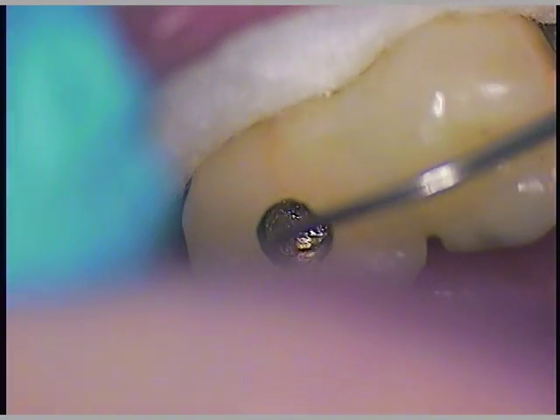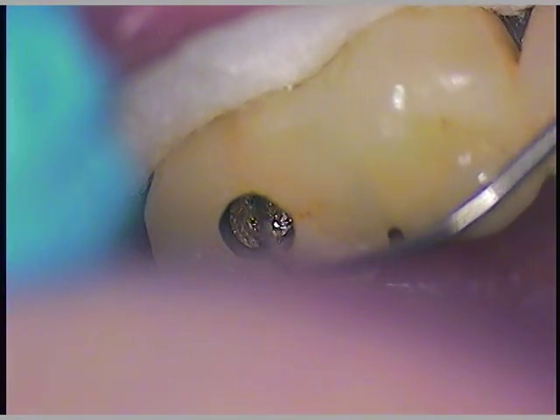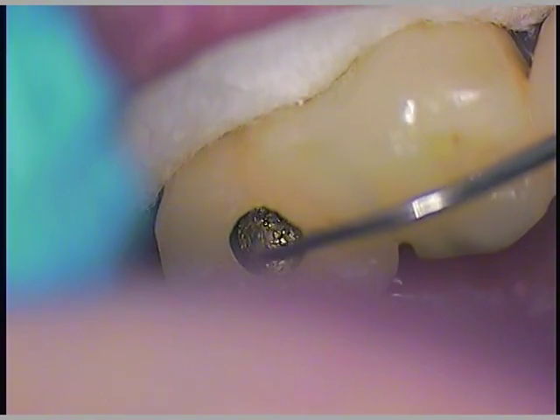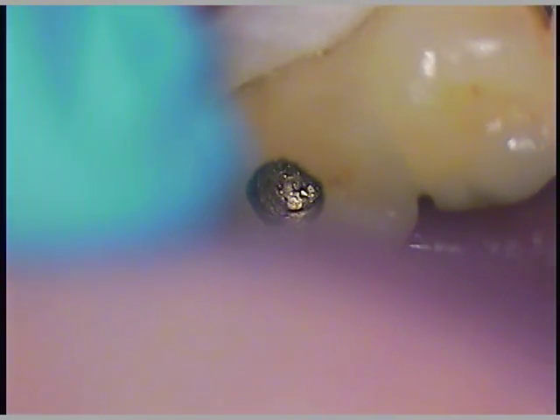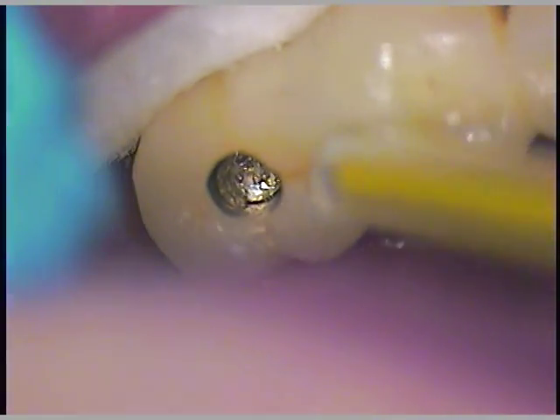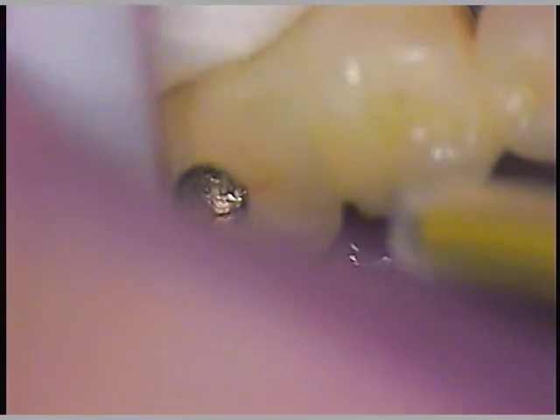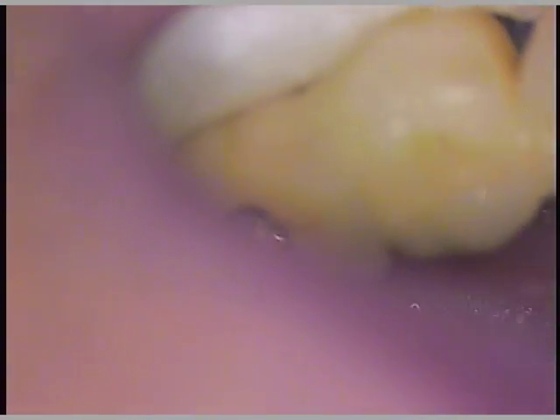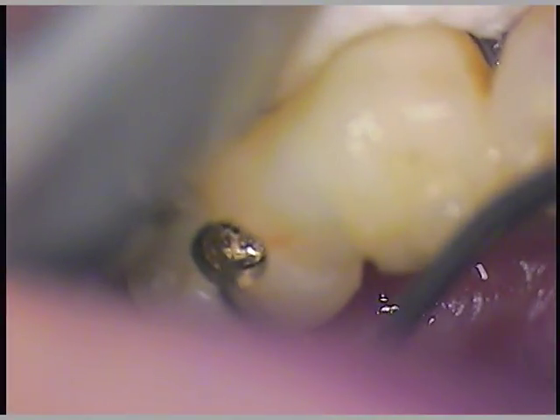I'm going to use some water here because it was coming out and now it stopped a little bit. Let's just get it lubricated with some water. We'll rinse it out thoroughly — it's probably just bio-burden. I really don't want to put any more solution in there if I don't have to, because it dissolves tartar.